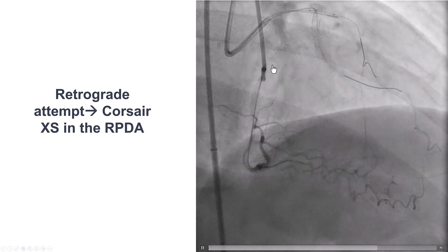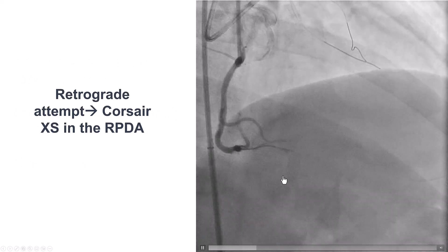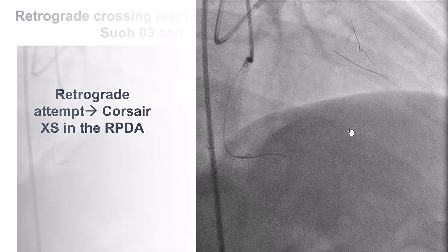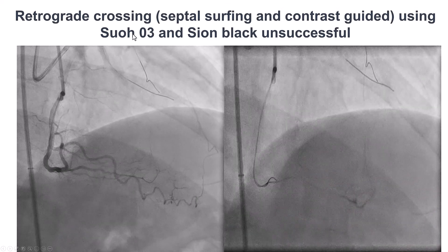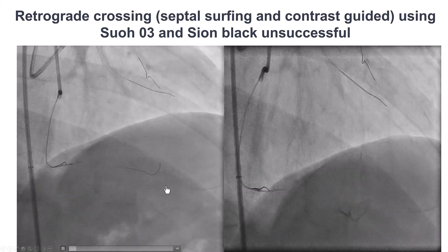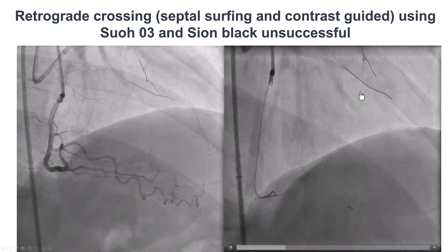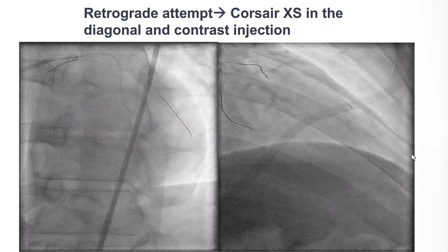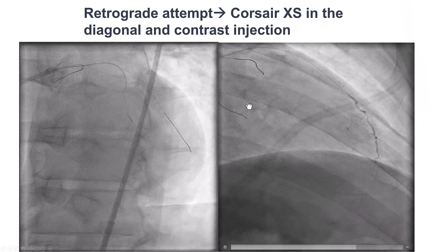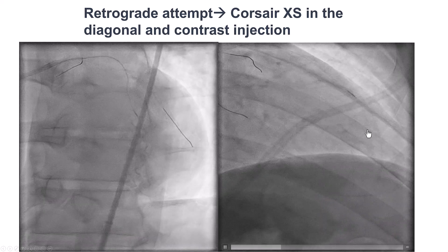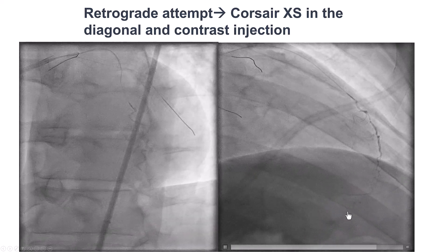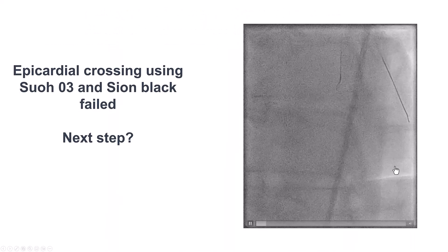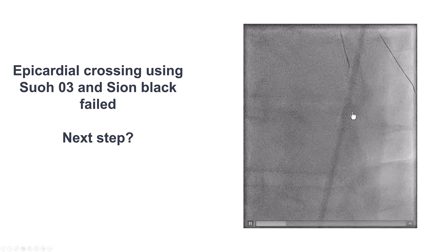We left a balloon inflated for a few minutes and then tried to go retrograde through the PDA via a septal collateral. Despite multiple guide wires including SUO3 and Xeon Black, we were unable to enter that septal branch and wire to the LAD. We then debated ADR versus retrograde through the epicardial collateral. Given the area of staining, we gave a brief attempt to the epicardial, but there was too much tortuosity and the vessel was too small, so we decided not to pursue further.